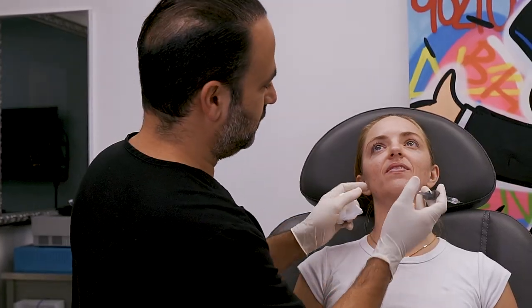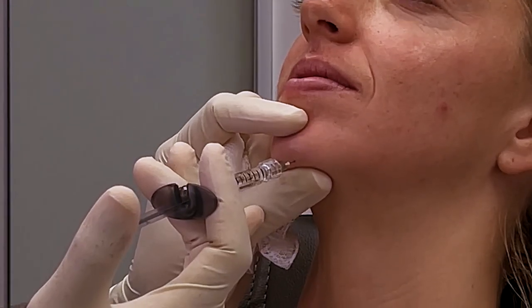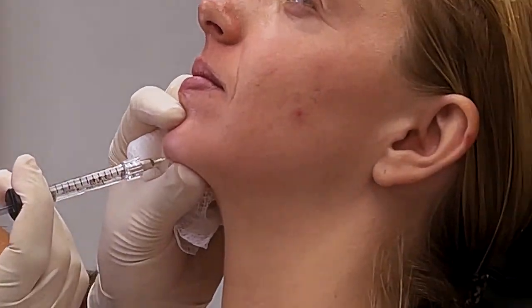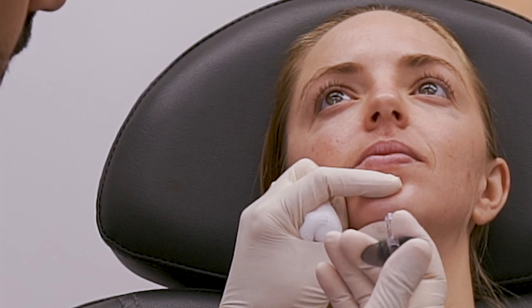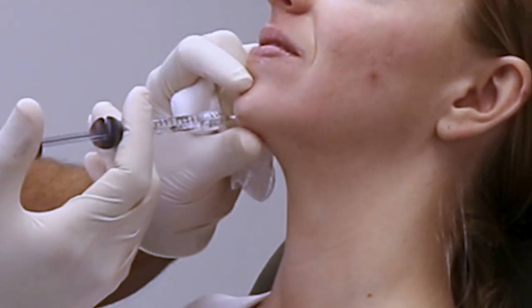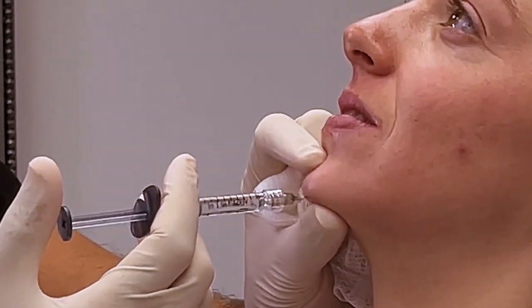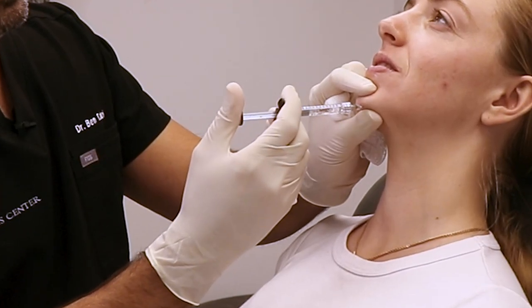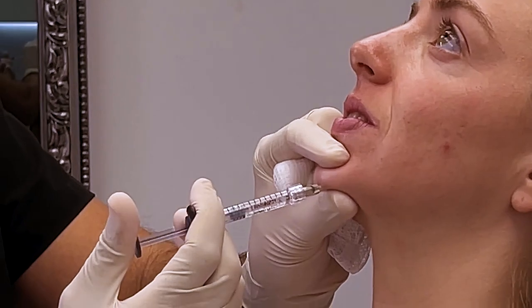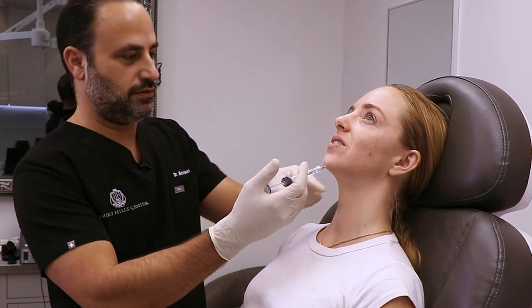Put your head back — gentle torture. When we go in the midline, we're doing bony accents, coming down onto the bone itself, onto the periosteum. You have to have your thumb always underneath on the chin. There's a very high chance — and it's very common — that chin filler will escape into the neck and start making a pooch under there. We're doing small aliquots. People want to build this out like a chin implant, but it's not a good idea. I'm doing less than 0.1cc aliquots as I march along through the same hole on the lower border of the chin, with a slight tilt pointing upwards so it does not escape into the neck.